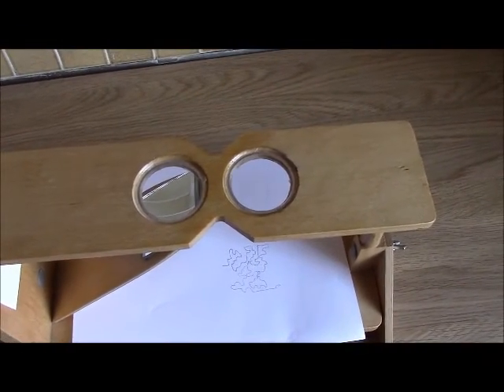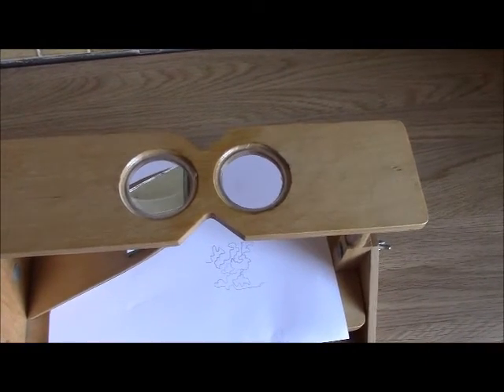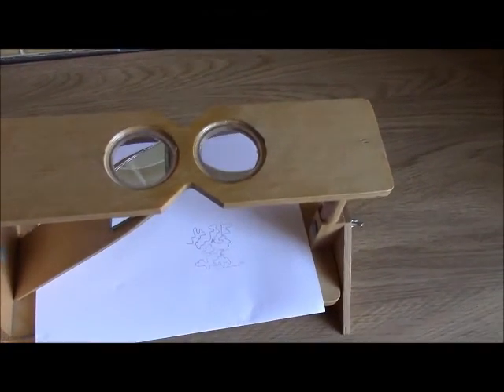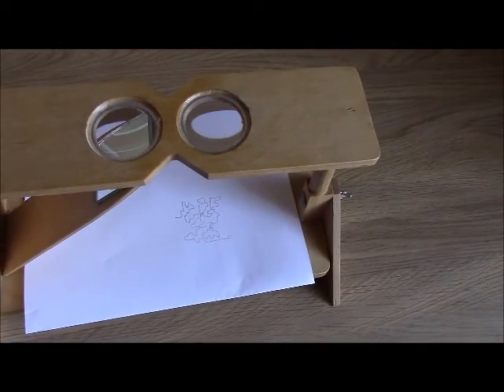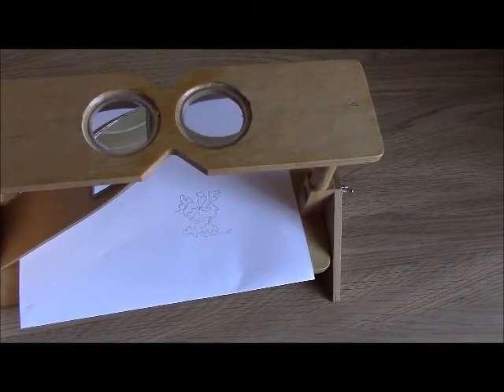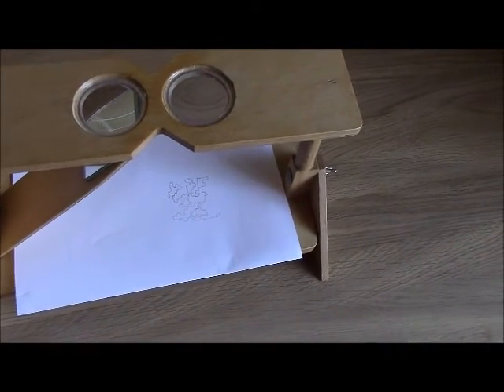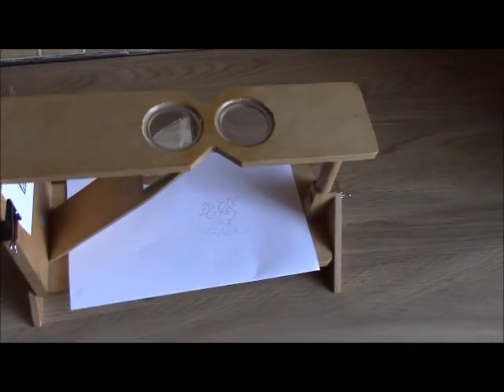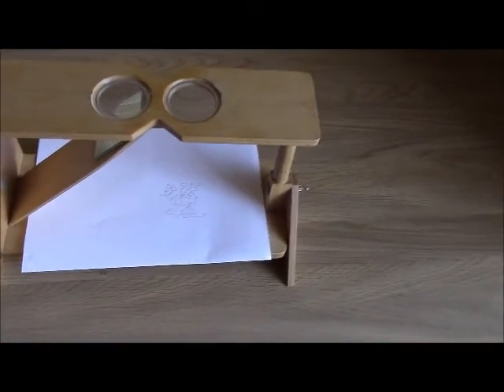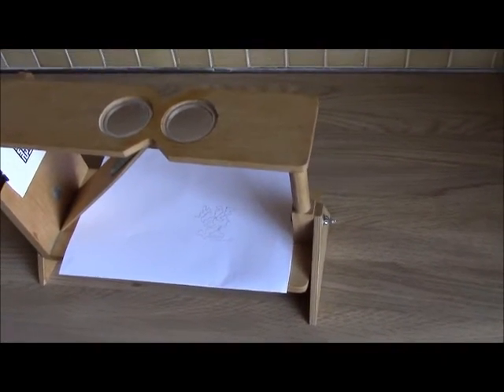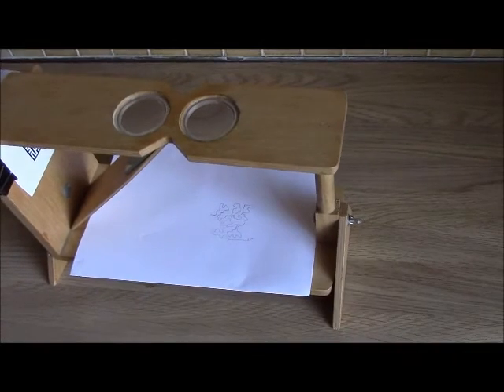This exercise not only forces you to align your eyes and refixate and keep the relative position of these images pretty consistent, but it also involves you moving your hand and drawing and doing other things. That's why it's a great exercise for kids who might be struggling to read or to write.